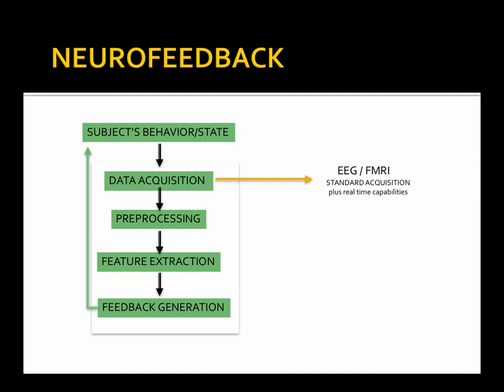In the Siemens scanners here, we don't have it, but for example, Michelle Hampson in ATL takes the features of the online reconstruction from the Siemens scanners and modifies that script to get the data. So it's feasible in any of the scanners.